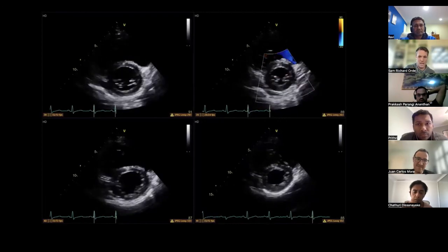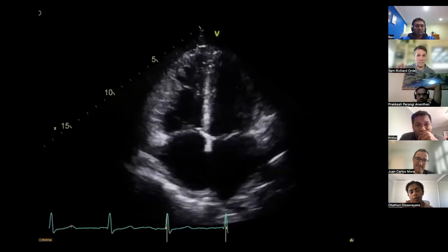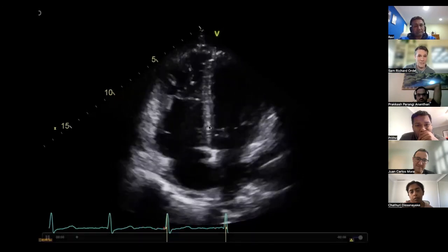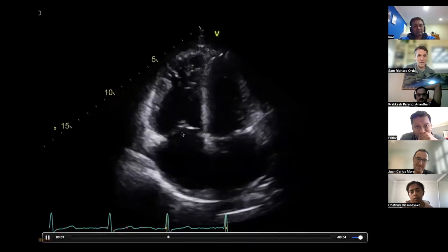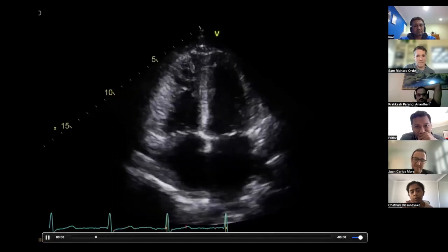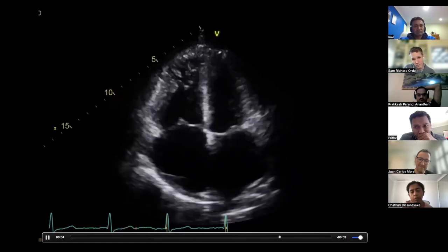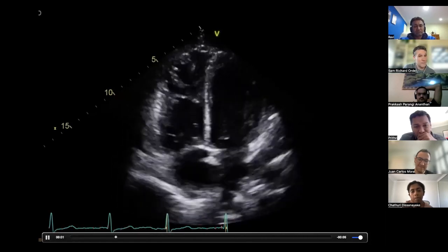Yeah, that looks generous in size. That looks abnormal beyond all get up. Something funny is going on. And it's the trabeculation and the big size of the RV that obviously means that we need to go hunting. And he was meant to have a toe done yesterday, but unfortunately had something to eat before he got there. But we'll go investigate it.